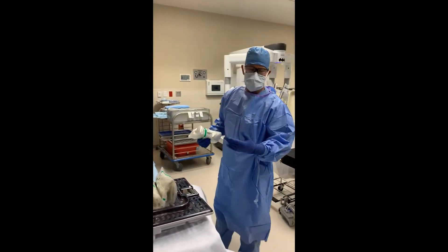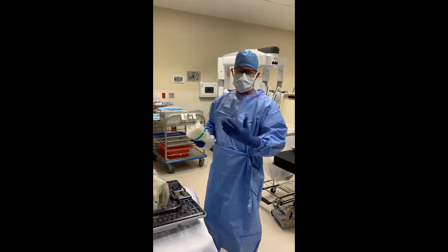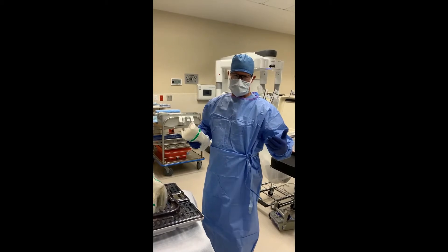Alright, so first and foremost, when you're going to drape the robot, you need to be double-gloved, because there's a very high chance that your hand is going to hit a non-sterile surface on the robot.